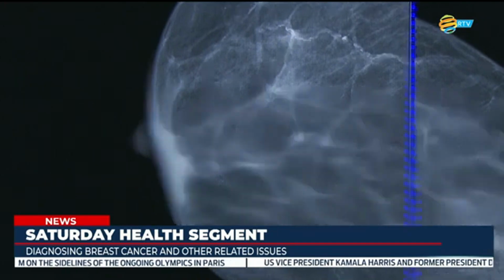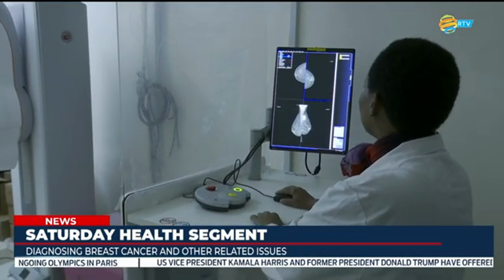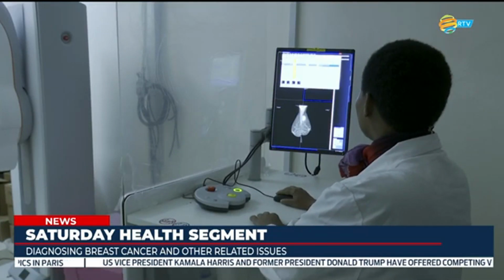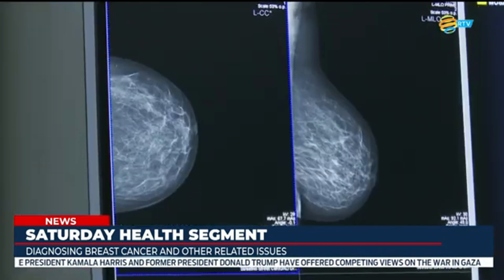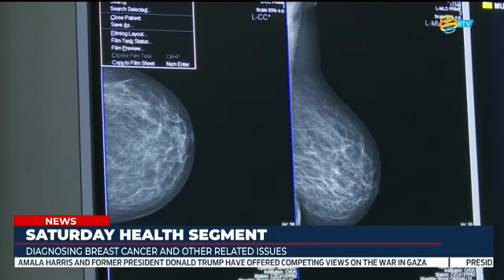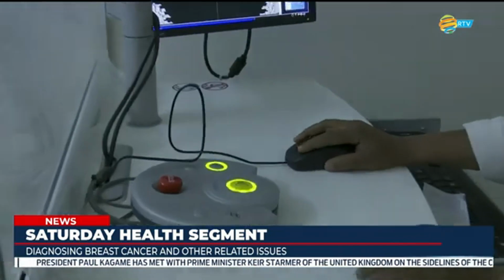Mammography itself, when you take the image, the breast tissues are superposed. It means that many tissues are taken into a single image, like 2D. While with this one, if you do 3D, it's like doing cuts into the breast so that a small region of 2 millimeters can be seen. So it will help us to detect small regions before they become aggressive.